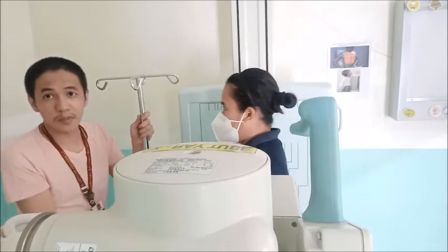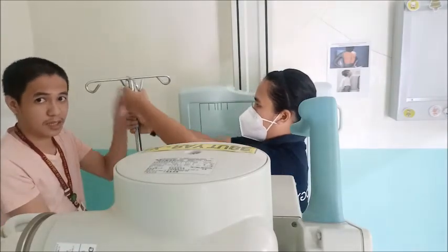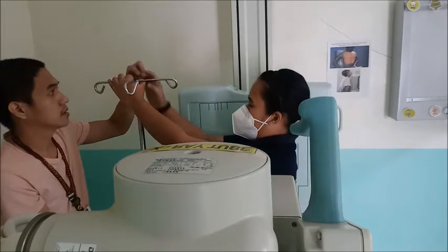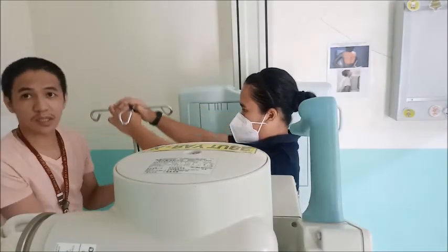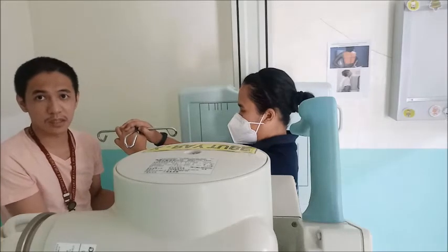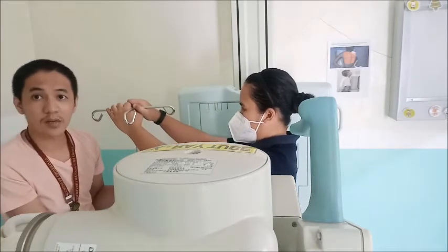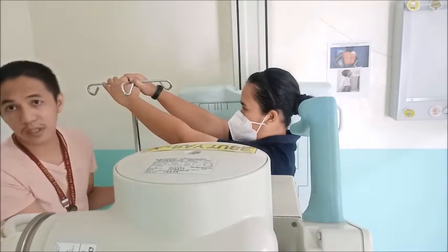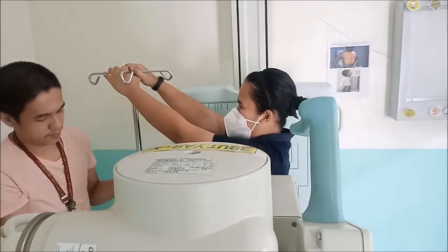So, you can ask the patient, kung maglisod, raise silang hand. Pwede siya ipahawid sa repeat nga area, or pwede sa taas. Pahawid mo sa patient, and then hinay-hinay nimo ang saka, until kung asa nila kaya.